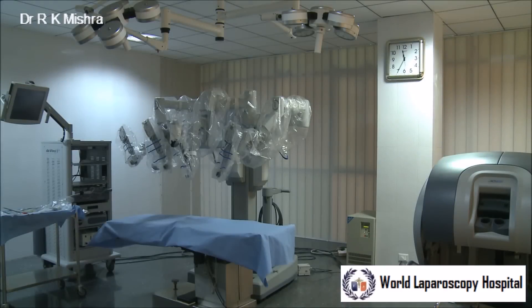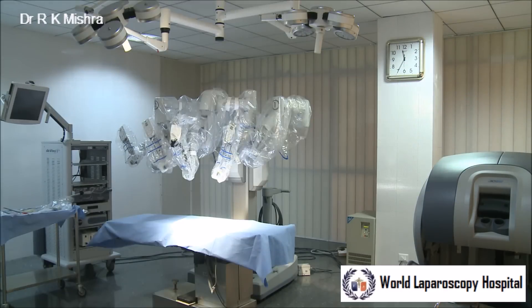Hello, good morning. This is our Da Vinci Robotic Operation Theater and today I will demonstrate some important learning skills.